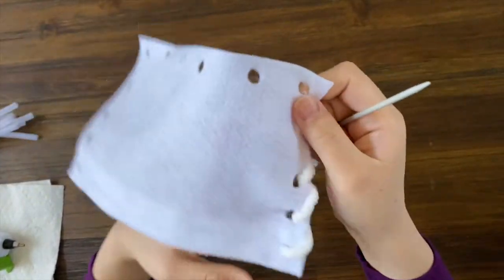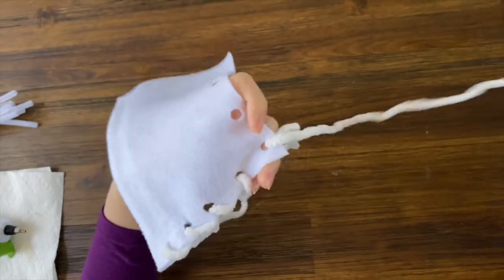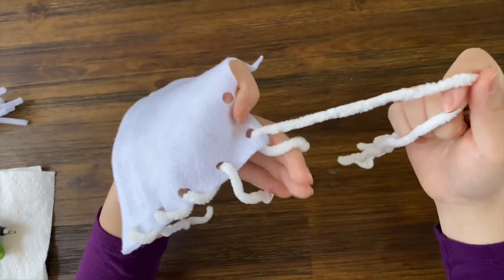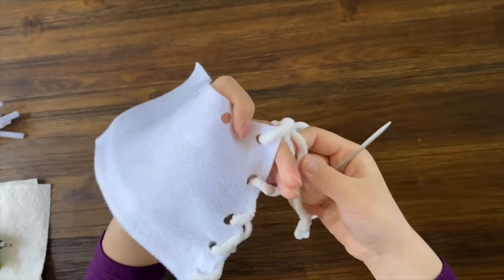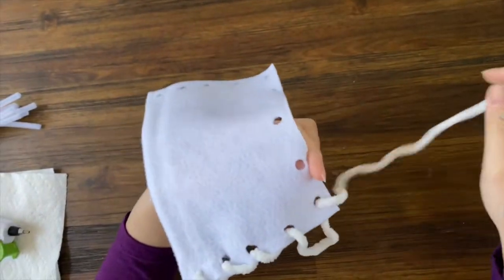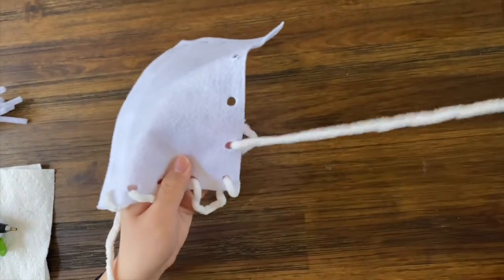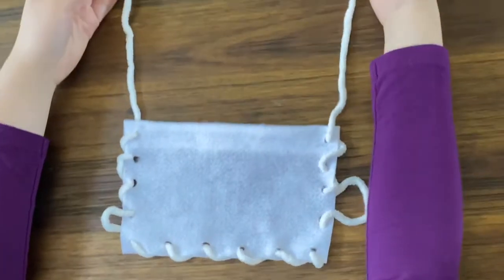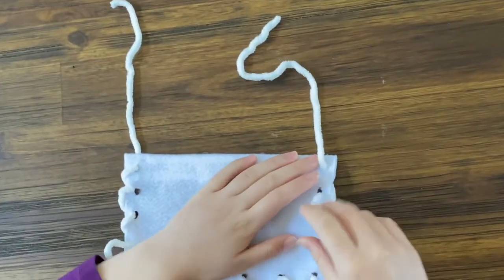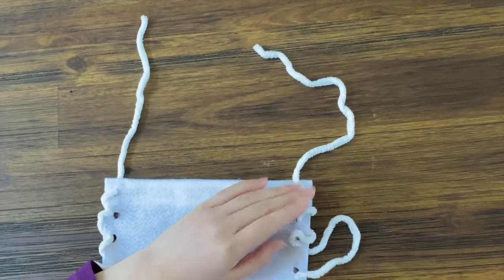And what you're going to do for this one is come up underneath again, but instead of pulling all the way through, you're going to leave about 3 fingers of space, because this goes around the ears. And then you're going to keep going until you reach the other side and repeat the same process. So if one side ends up longer than the other, you can just adjust it by pulling it through so that they're about equal, and just threading it through everything again.